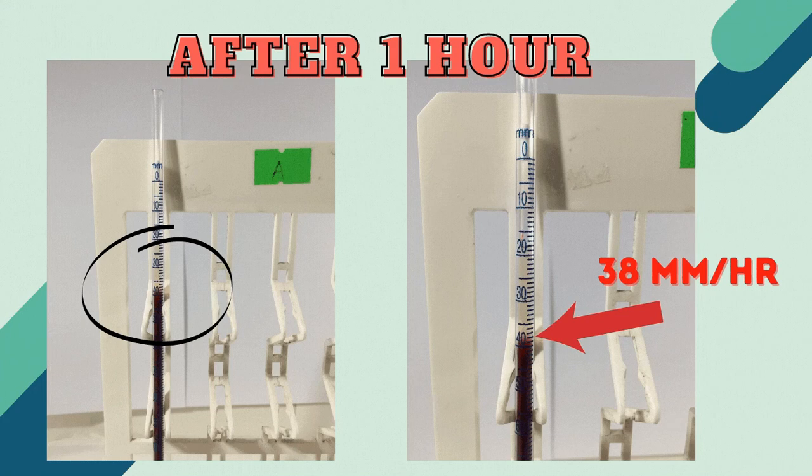After 1 hour, you have to record the number of millimeters the RBCs have fallen and report as millimeters per hour.